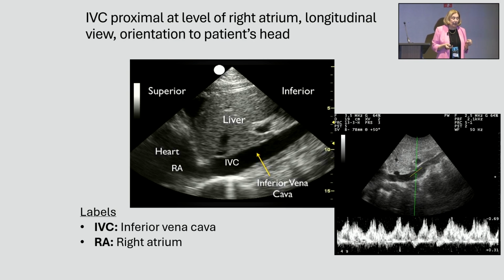This could happen. Now, someone who's reviewing you should be able to look at the scale and see whether it is approaching or receding. And it's another one of my soapbox issues that looking at positive and negative on that scale is important. And for those who don't do ultrasound, it's for those who do ultrasound to watch that the signal is coming positive or negative the way it should based on what you know.